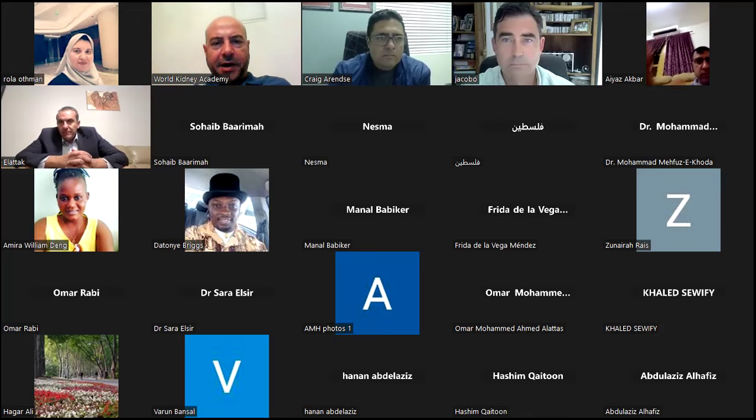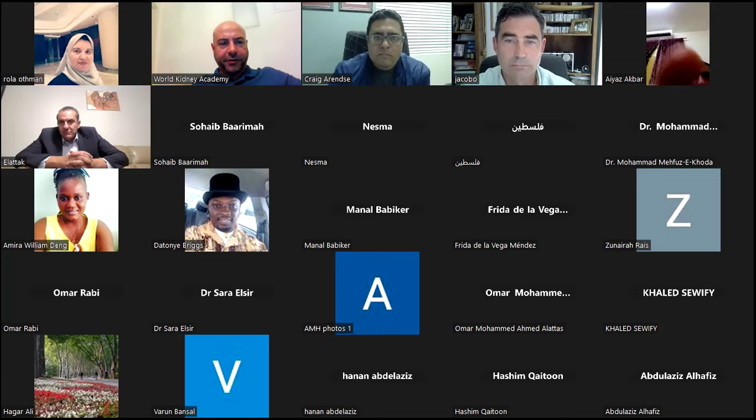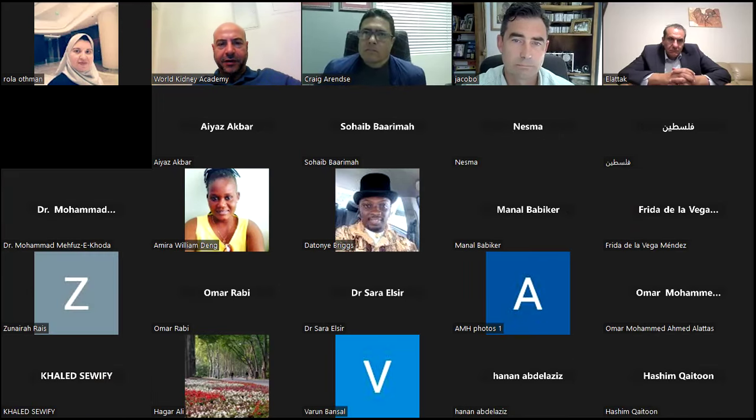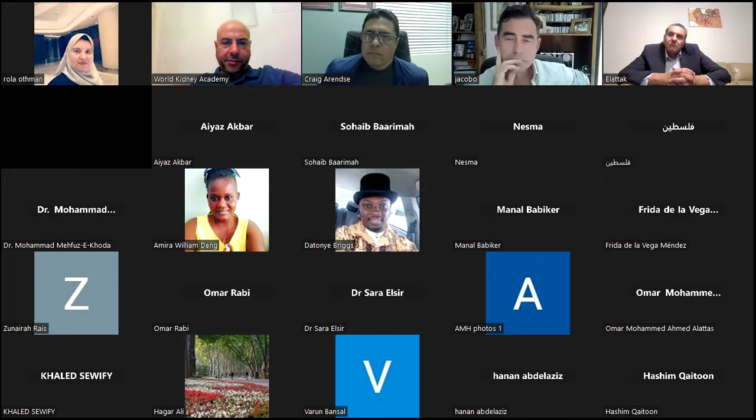Very nice. I think this is one of the take-home messages today: the prescription is not a static process, it's a dynamic process. We don't just initiate the patient on CRRT and let it go. Initially every 4 to 6 hours, we have to reassess our CRRT prescription according to the clinical conditions and laboratory status. Greg, what do you think?